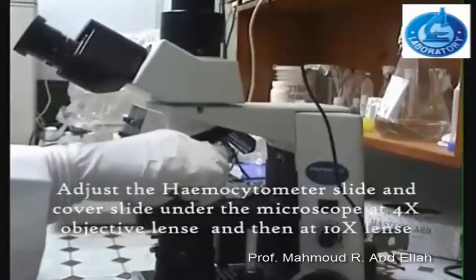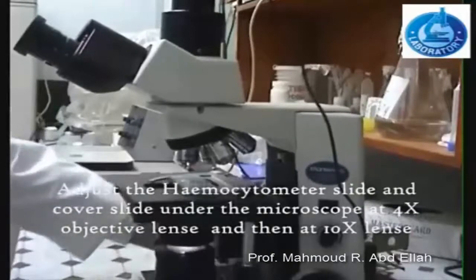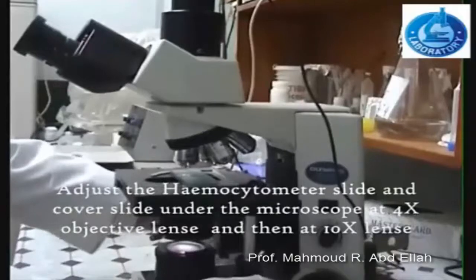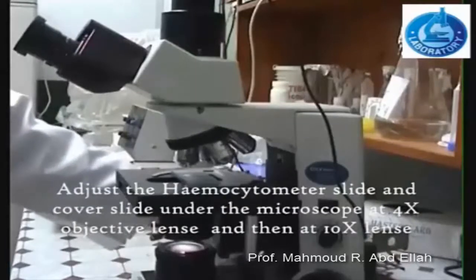First, put the Hemocytometer slide on the stage and elevate the stage up. Center the area containing the counting chamber below the objective lens.